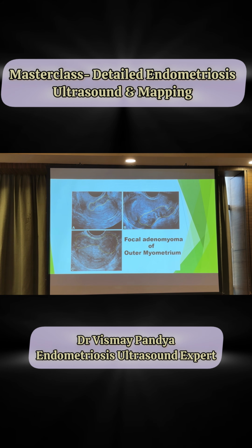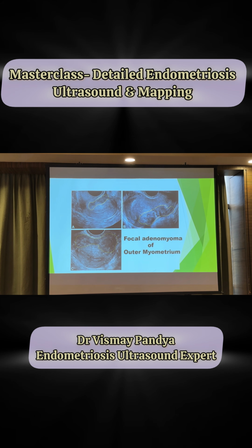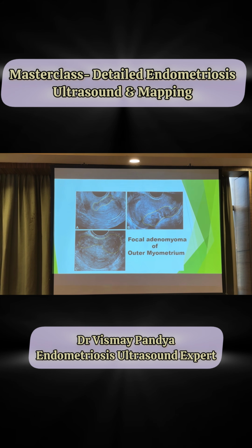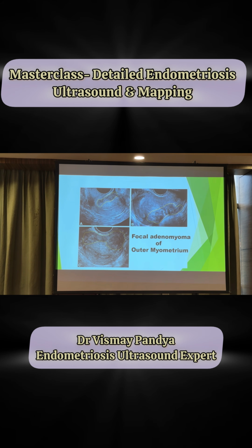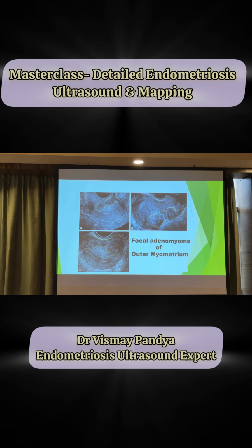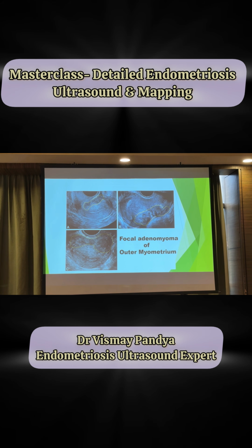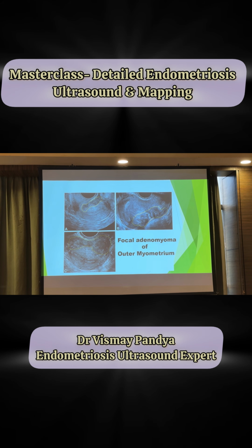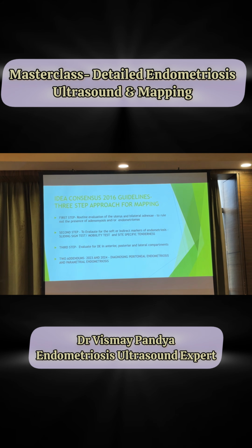This is focal adenomyoma of the outer myometrium. Now, why should it be differentiated from a diffuse adenomyosis? Because here you can see the EM junction and the endometrium is very beautifully maintained. So in such cases, if you are doing microwave ablation rather than adenomyomectomy, the treatment for this FAOM will work very beautifully, because you are far away from the endometrium and there is no way you can damage the endometrium.